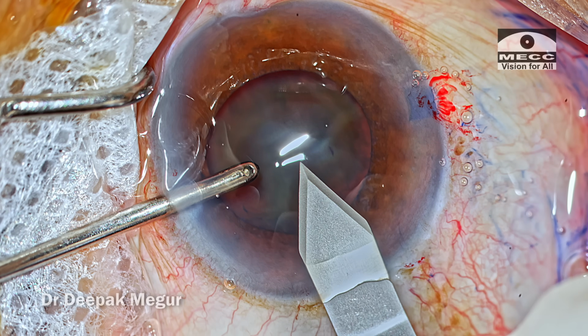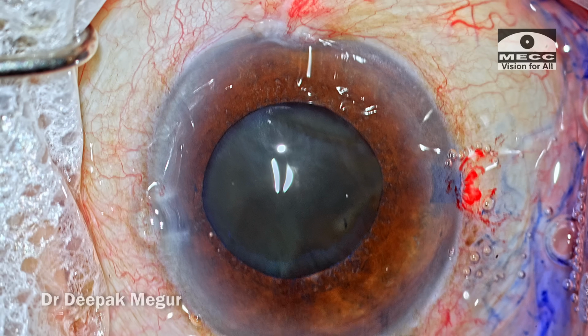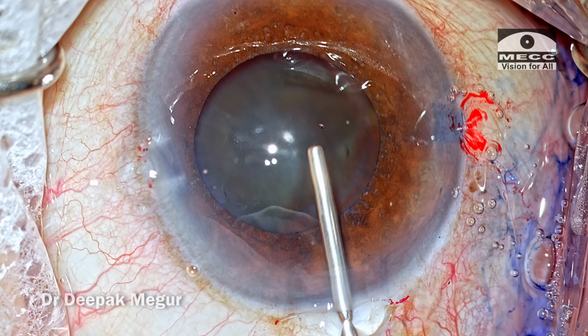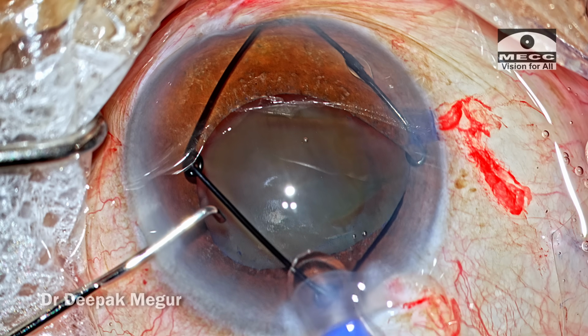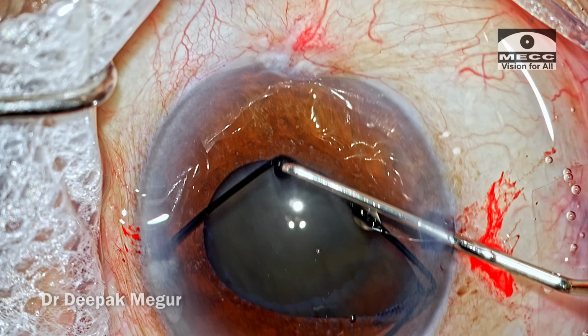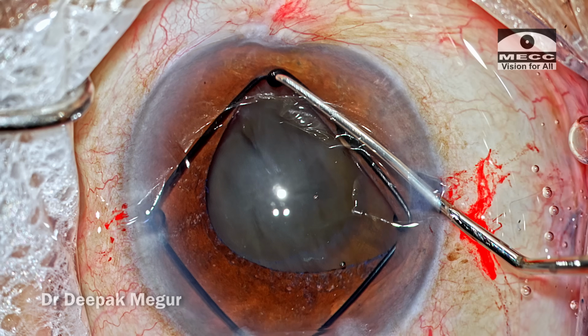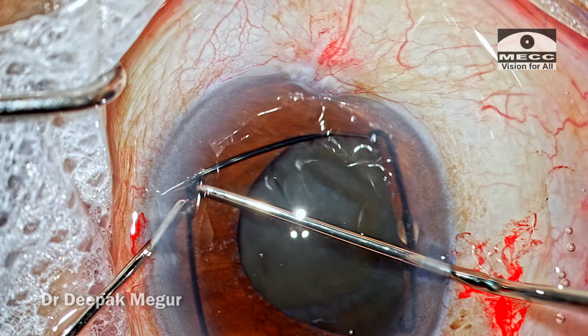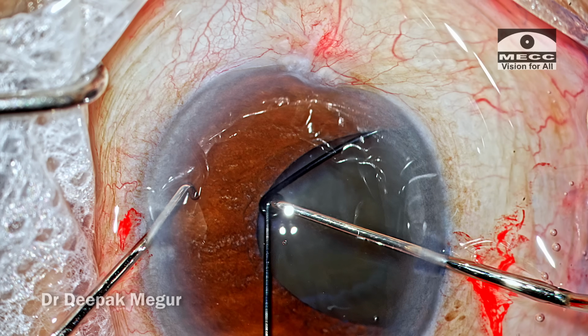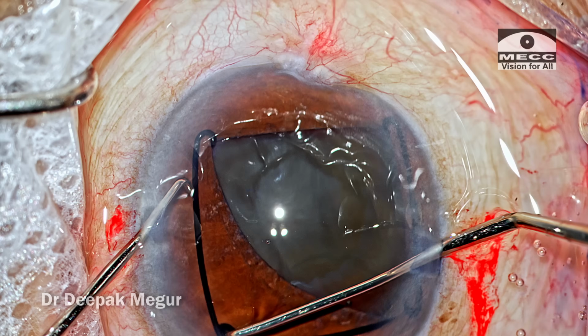Now I'm expecting some complexity in this case, so I want a good visualization. So I'm going to use a pupil expansion device. In this case, I'm going to use the Gupta pupil expansion device, and the device is loaded onto the cartridge. It is placed in the anterior chamber on the surface of the iris. And using 2 Sinskey hooks, each of these notches are then engaged onto the pupillary margin.